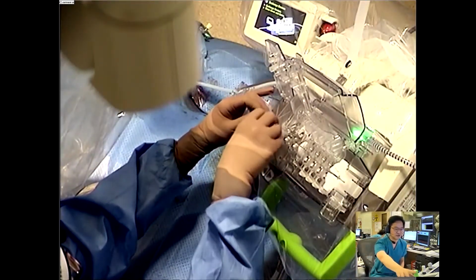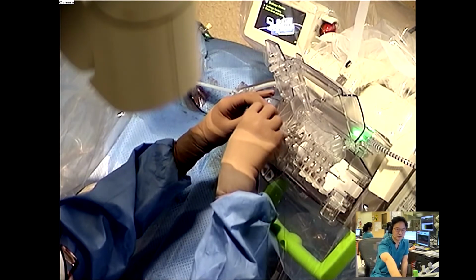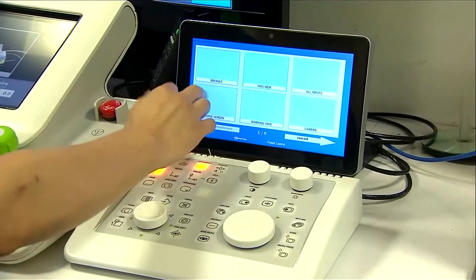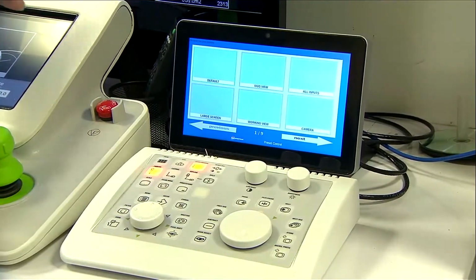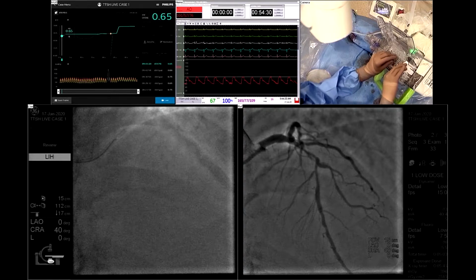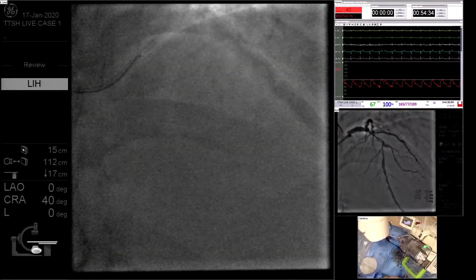Now you see this little panel on my right-hand side. On this, I have various custom setups. I can make sure I go to IVUS. By default, I have the live screen and the reference screen on my right, and my hemodynamics. I can still see what's going on inside the lab. But sometimes, as I get older, I want things to be a bit bigger, so I can go large. I can go very large, and I can almost smell what's going on inside.